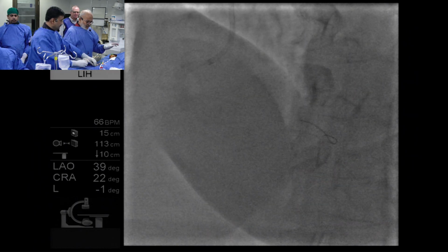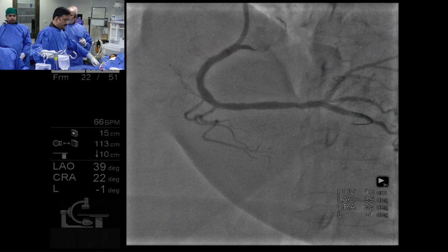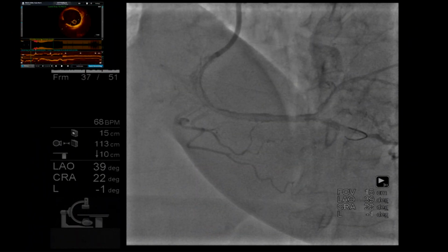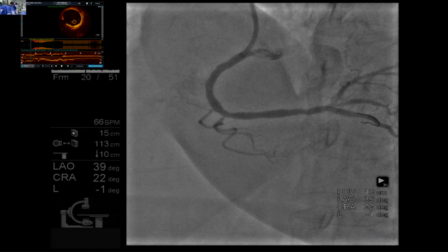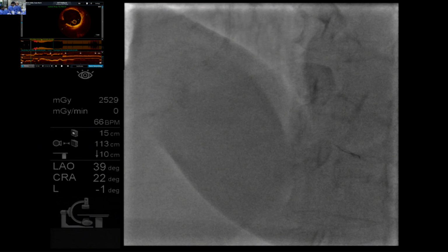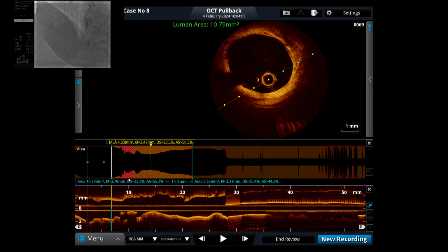OCT. It's important to see the OCT in that region. Why give 1 cc diltiazem? There is a good chance that she has renal. Okay, it has gone distally. Just check it. Sanjay says that we have a U distally, and if we can make it, let us try it out. I am not sure.